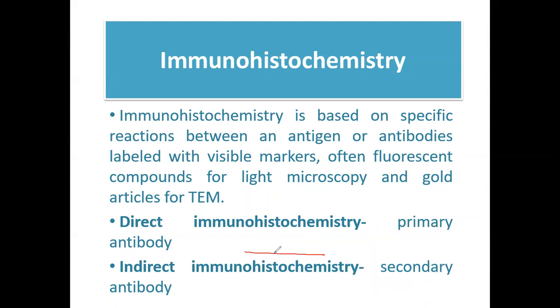Ayan, ulitin natin na. Ito yung tissue natin. Yan, meron siyang antigens. Ngayon, nakabind na sa kanya yung primary antibodies natin. Okay, nakabind na. Ngayon, nagdagdag tayo nung secondary antibodies. Guys, yung secondary antibodies natin ay labeled. Saan ibabind ni secondary antibody si primary antibody?